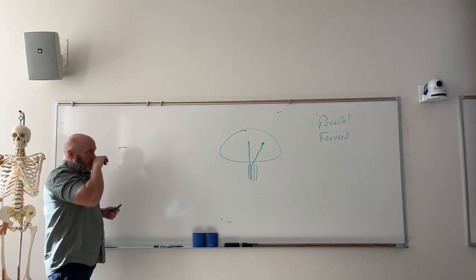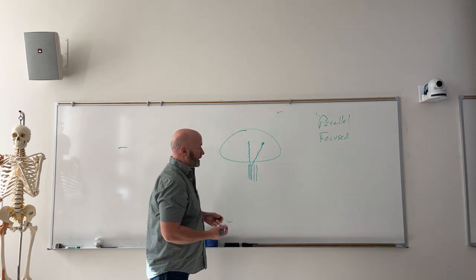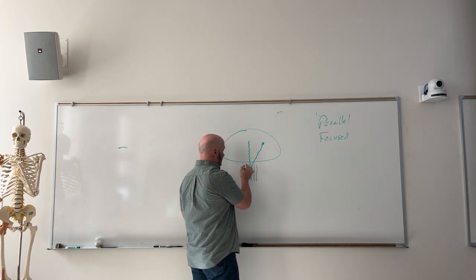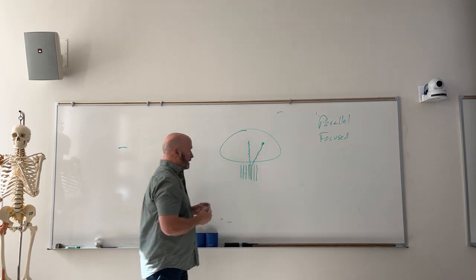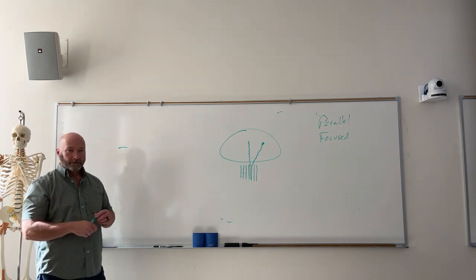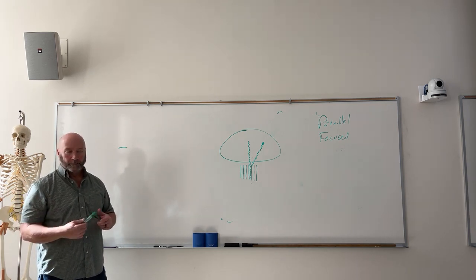All right? So the purpose for the grid is to absorb wide angle scatter, to absorb it before it makes it to the image receptor. So a parallel grid is very simple to create. All they do is they take an interspace material and they sandwich it between two pieces of lead. All right? So you just got alternating pieces of radiolucent material, alternating pieces of lead. So you got lead, radiolucent, lead, radiolucent, and so forth. Interspace material can be made of a number of different things. Plastic is common. Paper used to be common, but the problem with paper is that if blood or body fluids got down inside of the grid, you've seen what happens if you drop a book in water, right? What happens to the pages? They just fill up with water and they're distorted from that point forward.